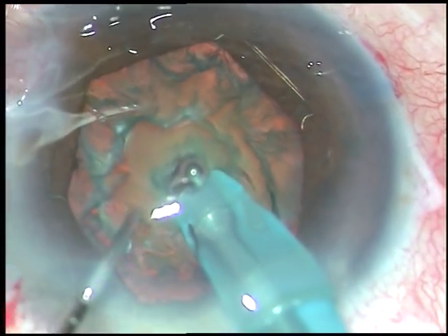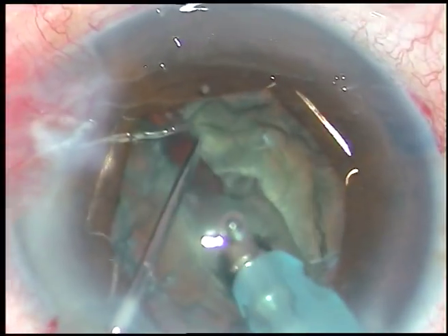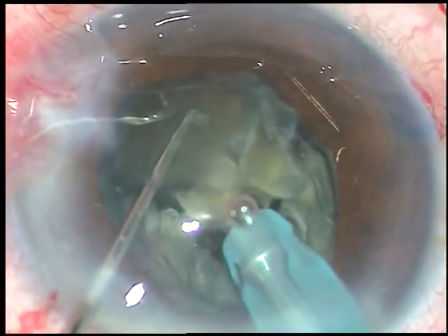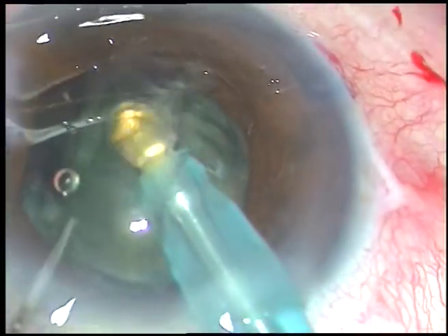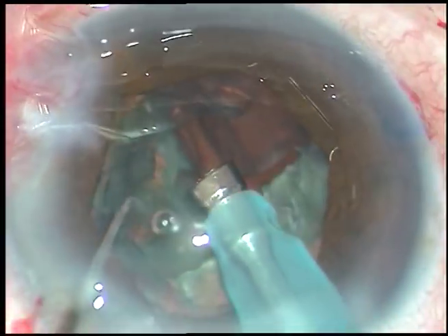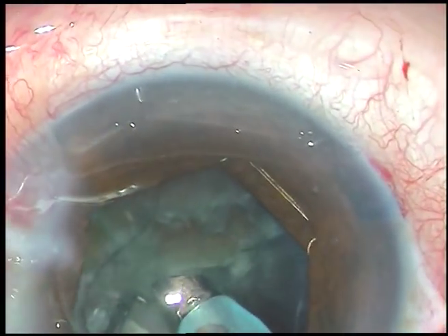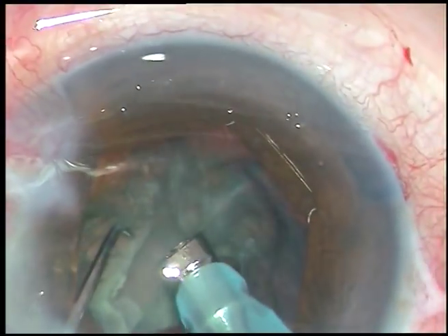The nucleus is held firmly and it is chopped. Now the nucleus is rotated and it is chopped at another place. Now this free nuclear fragment is emulsified and removed. The nucleus is rotated again. The fragment is separated from the hemi-nucleus and it is emulsified and removed.